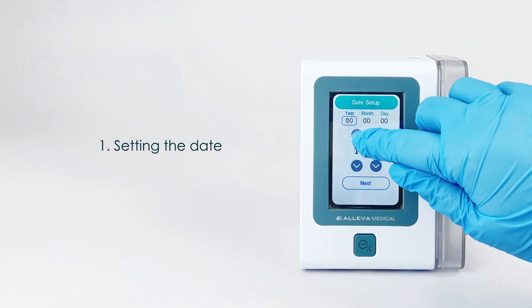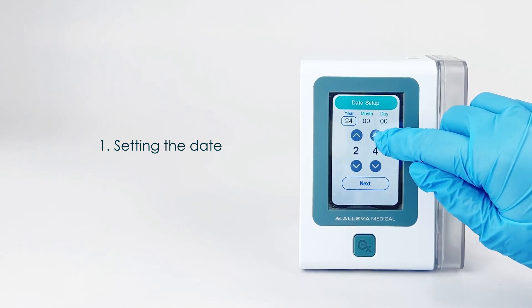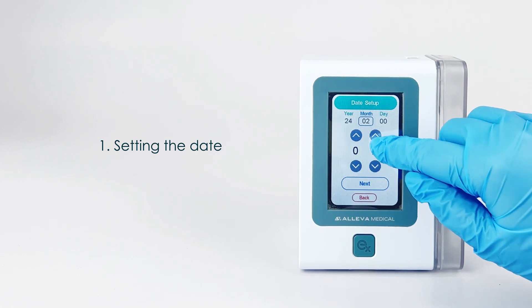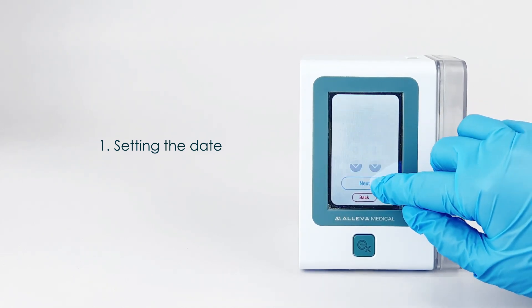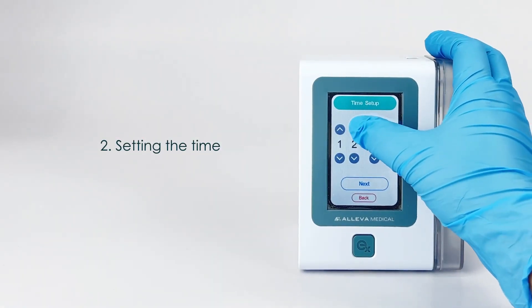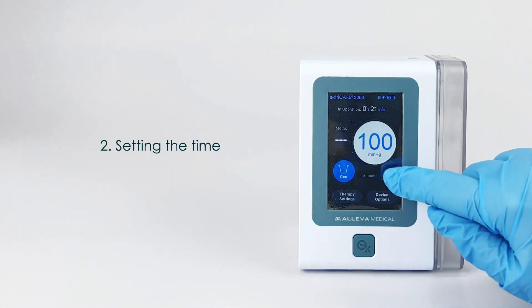The first time you use the ExtraCare 3000, you will need to set up the date and time on the unit. Please follow the prompts on the screen. First, set up the date from year to month to day. Press Next and then set up the time. Once the time is entered, press on the Confirm button. The main page will then appear.